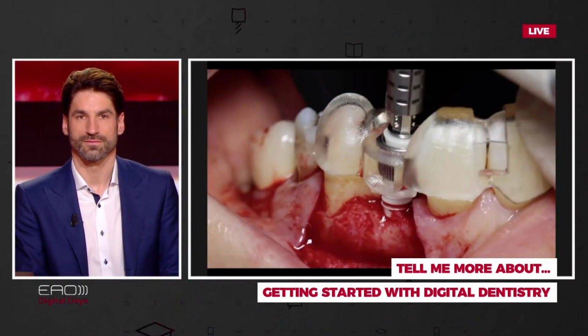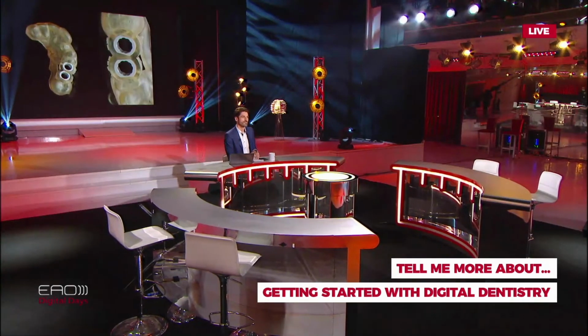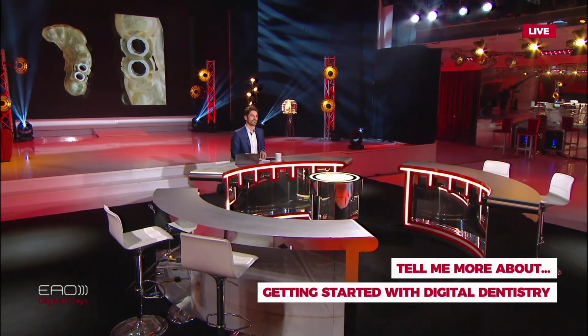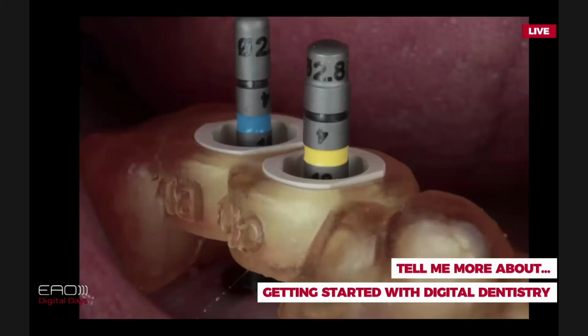Imagine if you don't have a guide and you're comparing this accuracy with your free hand. All the literature, or the majority of the literature, tends to show you that you're much better with a guide, whichever guide it is, than with the free hand. But obviously, if you're comparing, within the same protocols, what you planned and what you had, then you have some deviations that are important to recognize. You understand that they may be a mistake.